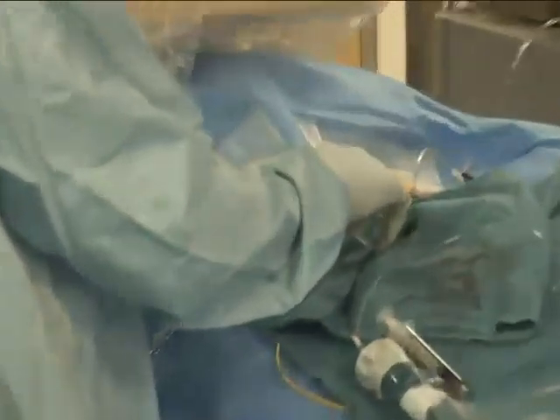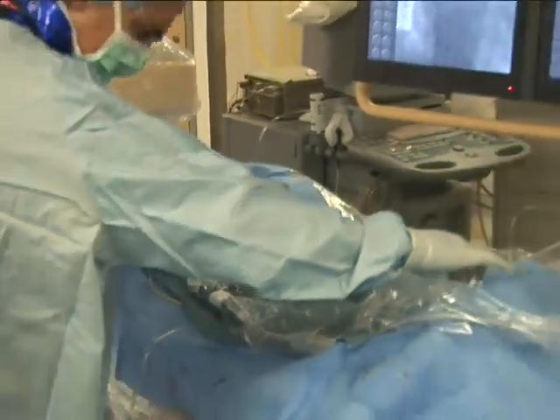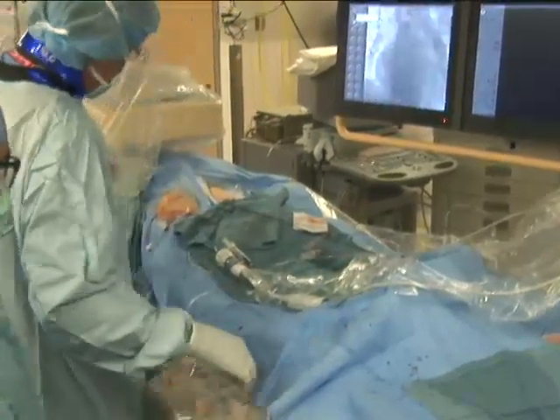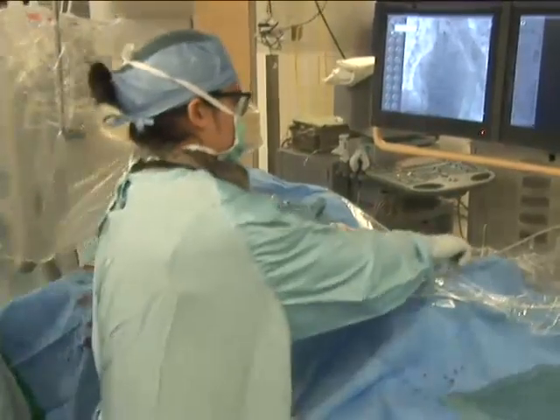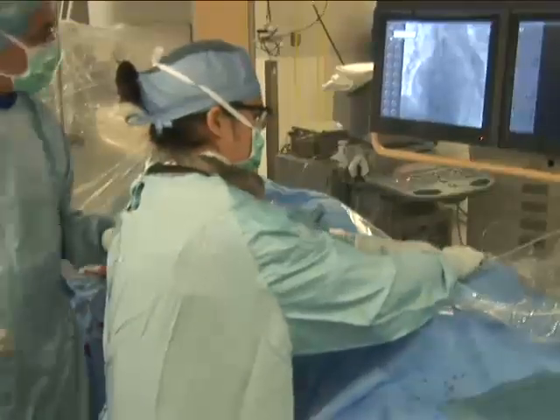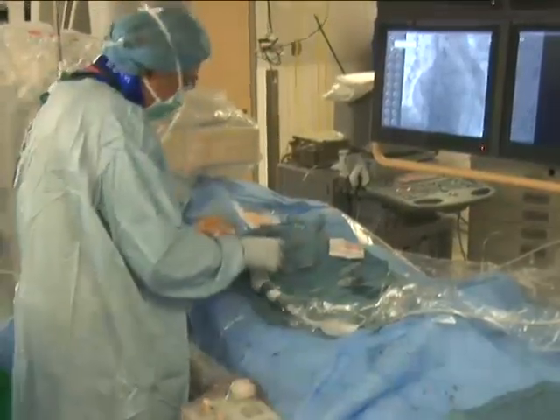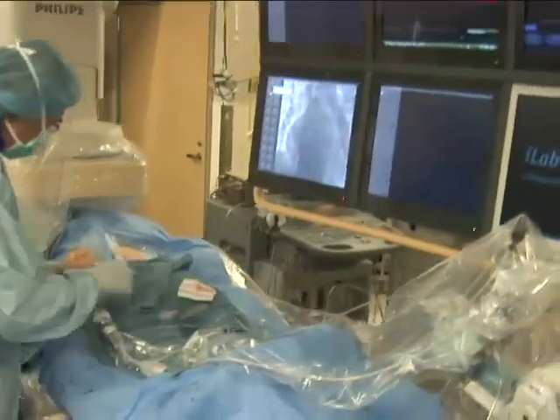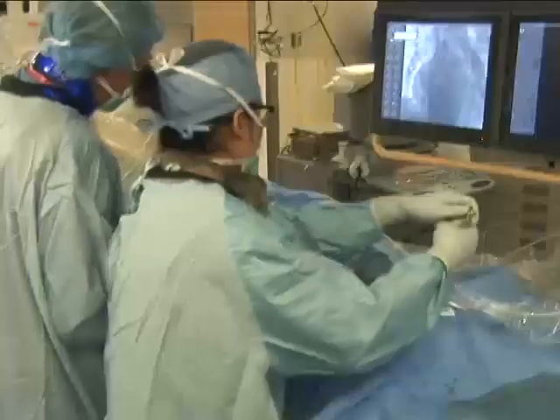Once the dilator is across, it is stabilized with the right hand and the catheter advanced with the left hand. Once the catheter is seen to be across the septum by fluoroscopy and TEE, the dilator and needle can be removed in a controlled manner to minimize inadvertent introduction of air into the catheter and left atrium. The catheter is aspirated and flushed and connected to pressure monitoring.